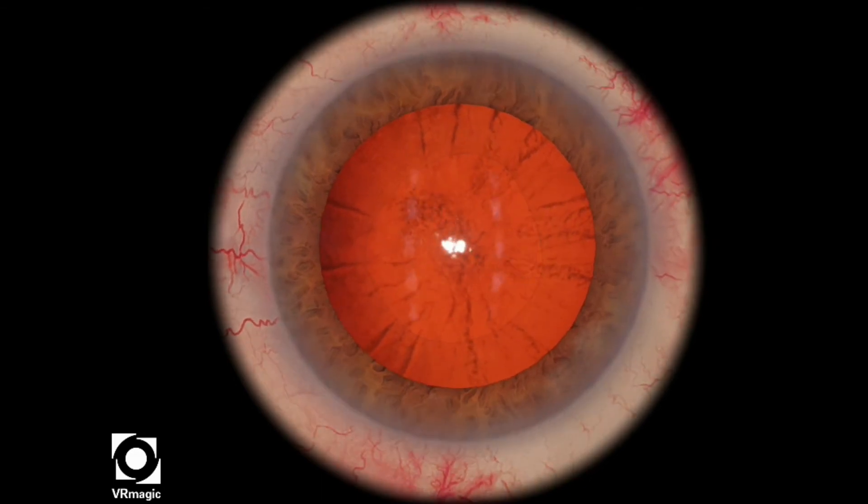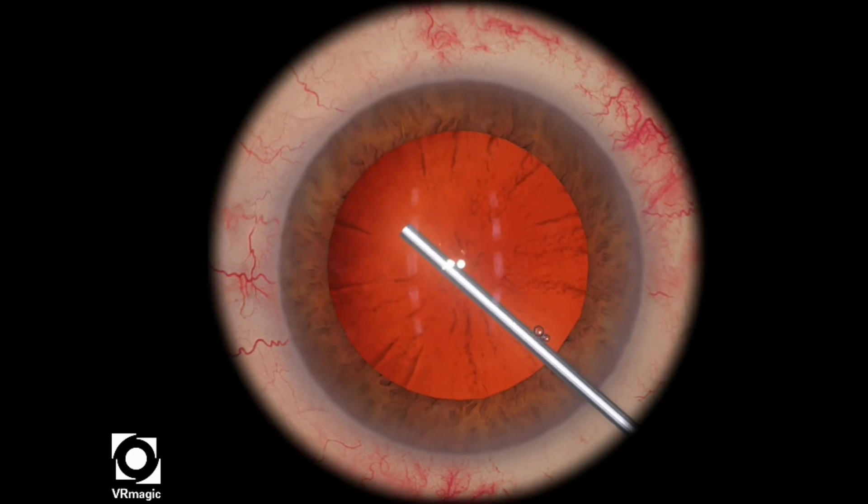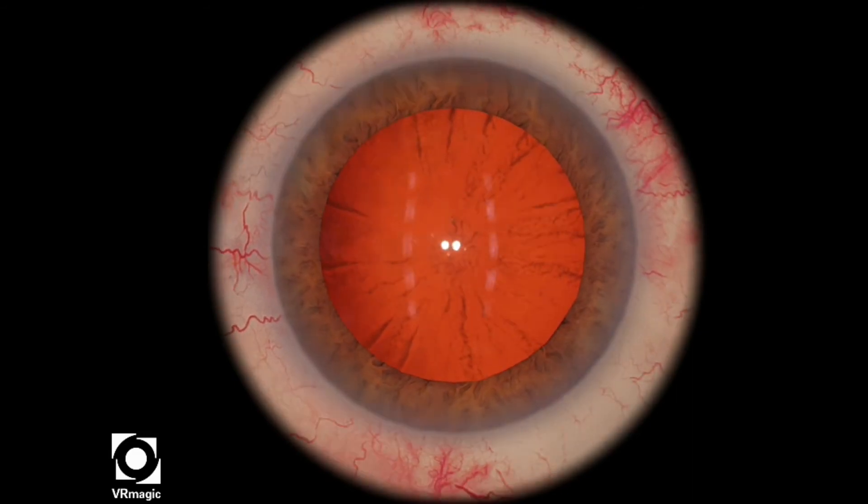That looks pretty good — a little bit ovoid towards the 2 o'clock area, but it looks relatively good. So let's take a look at that one more time.